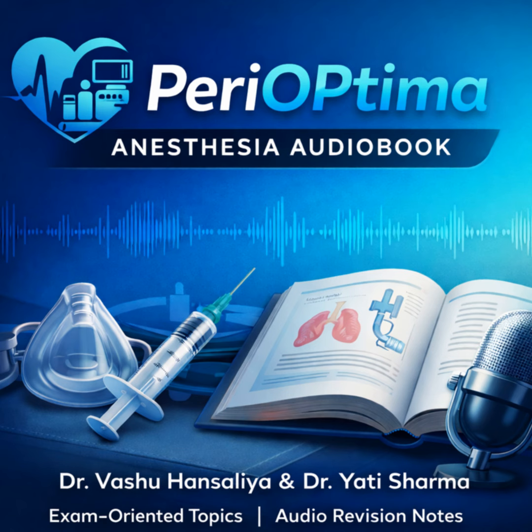That full phrase is important. So the moment you anticipate difficulty with both intubation and ventilation, this is your go-to. That's it. The ASA difficult airway algorithm fundamentally stresses this approach because it maintains the patient's protective airway reflexes, it preserves pharyngeal muscle tone, and most crucially, it maintains spontaneous ventilation, SVA. If your first most controlled attempt fails, the patient is still breathing on their own. And that buys you precious, precious time.